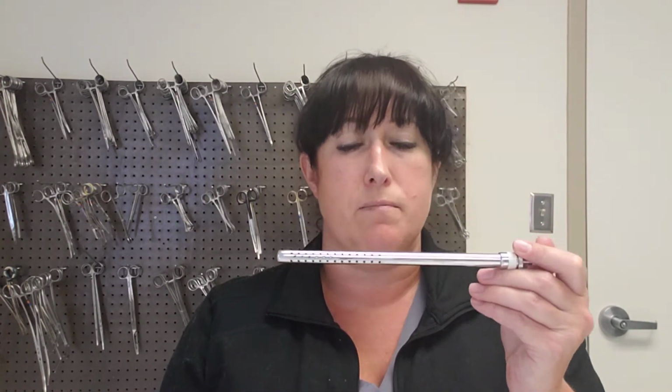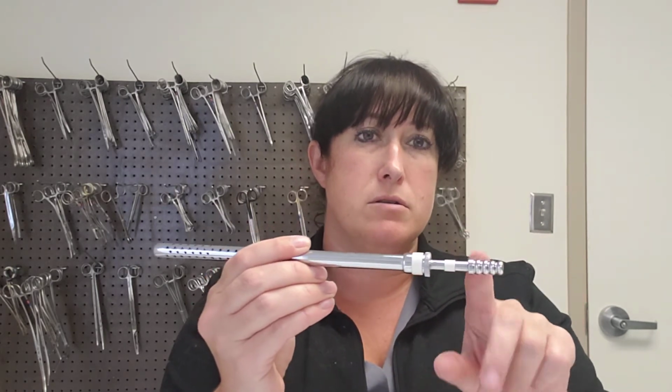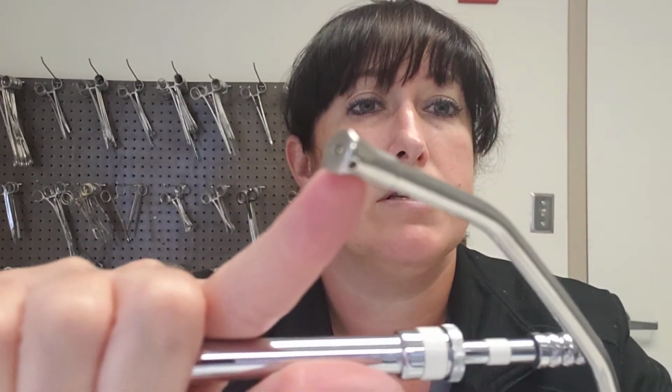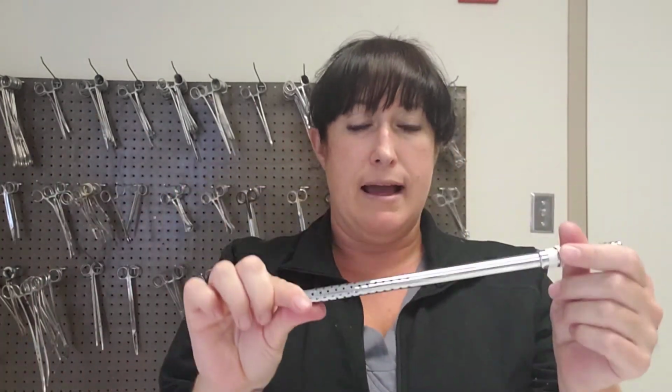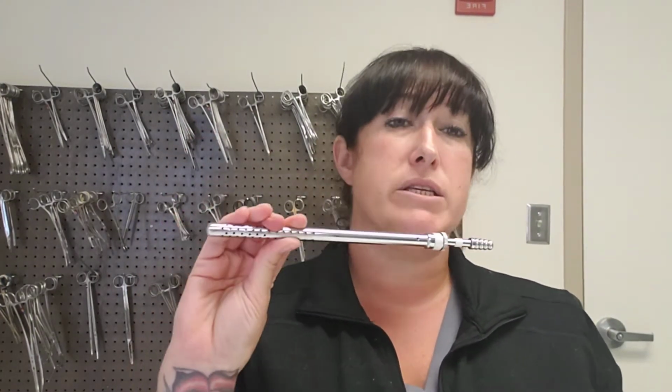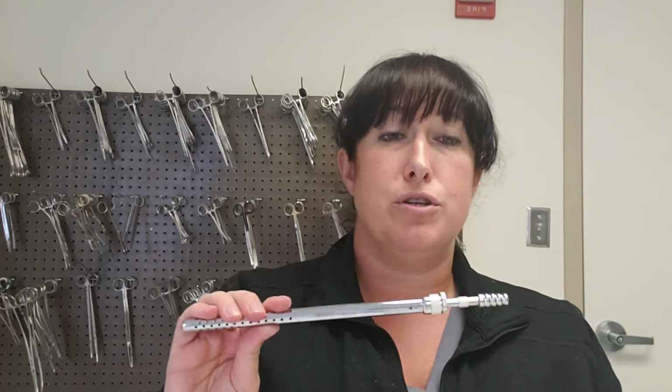If you are in a case where there's a lot of fluid, you will need to use this Poole suction. This is the tip that hooks to the tubing, and this is what suctions in. As you can see, it's got all these holes here. These only had the holes here at the tip. This has a lot more. This is going to allow you to suction up a lot more fluid at the same time versus this. So do you need this all the time? No, you just need it when you're using a lot of fluid.